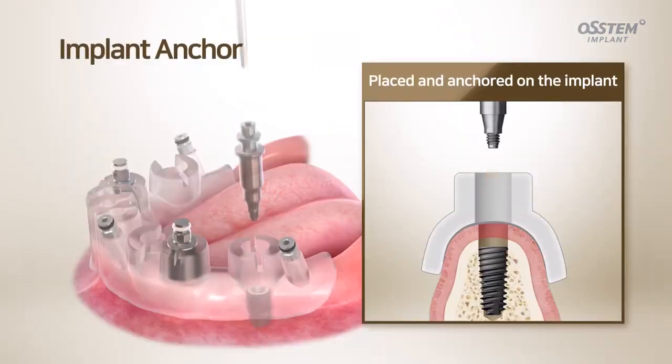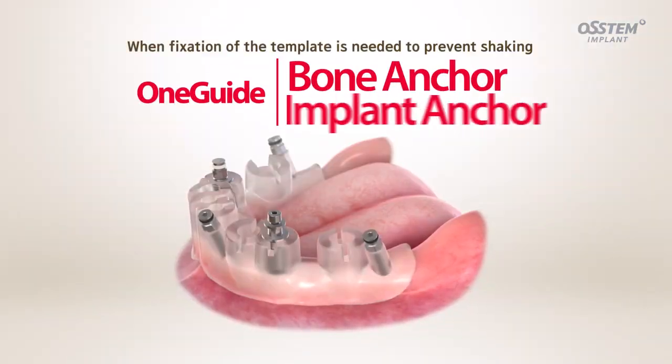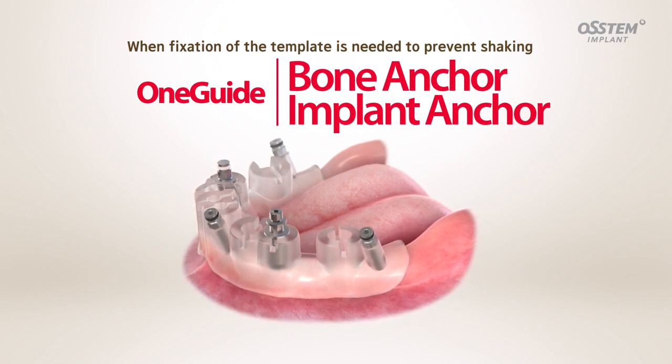The OneGuide Implant Anchor can be fastened to an implant already placed in the patient's mouth, which helps anchor the template much more easily. If you need to prevent the OneGuide from shaking and secure it in position, try using the OneGuide Bone Anchor and Implant Anchor.